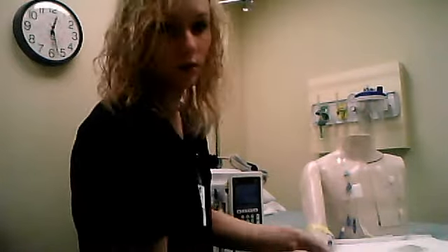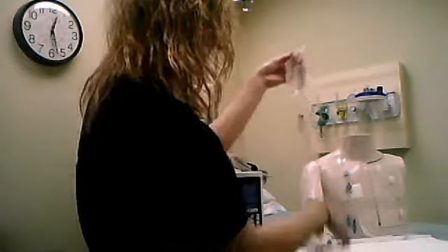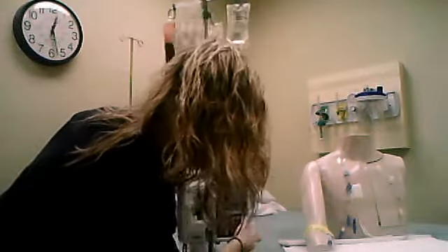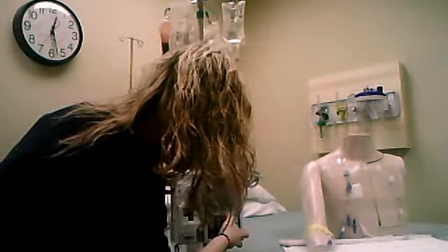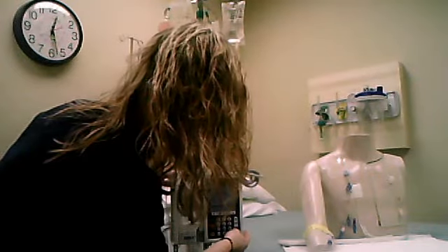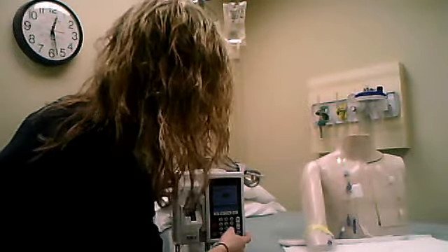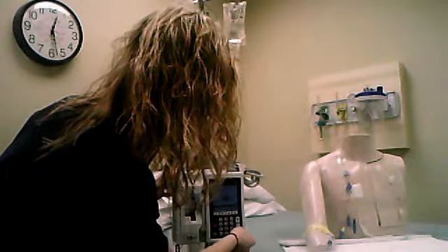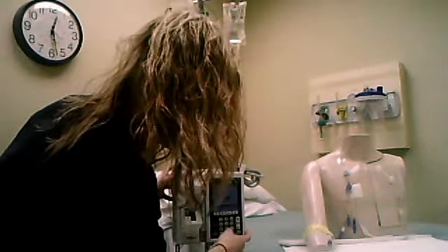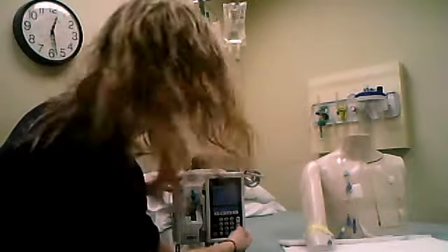Make sure that the roller clamp is open. And hang that up. And this will be piggyback at 618 milliliters per hour. The volume to be infused is 103 mils. And that gives us 10 minutes, which is what is ordered.